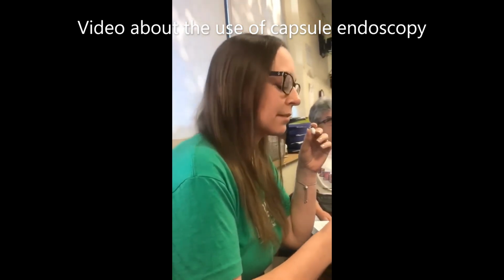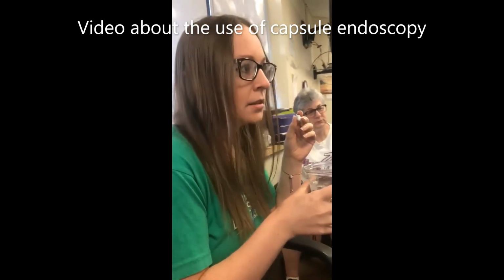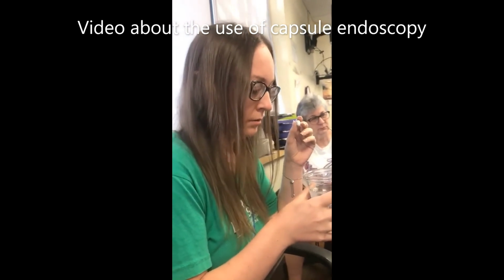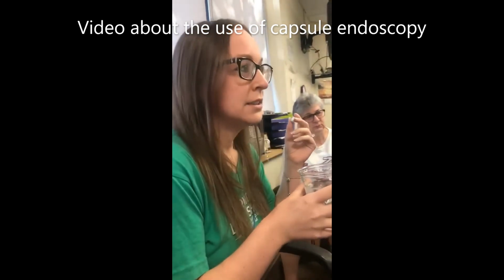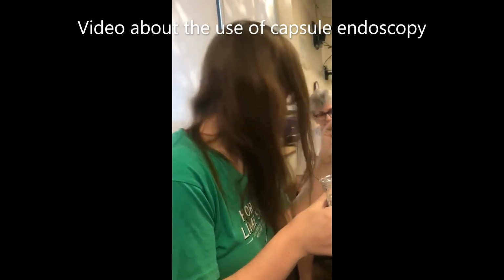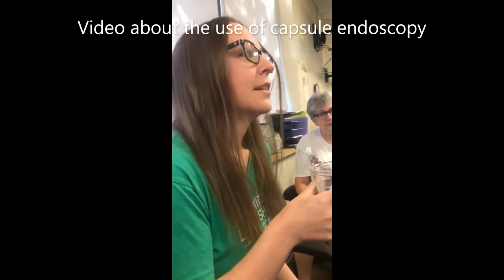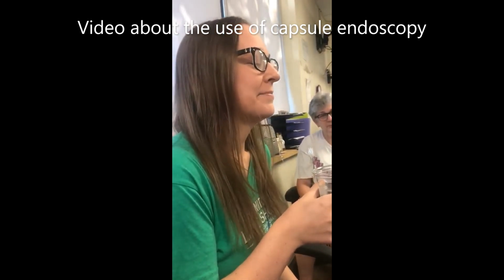I actually recommend that once you get it in and get your mouth full with water, tip your chin down, because the capsule will float to the back. Okay. The nerves. You're just having your favorite breakfast or something and swallowing it down.